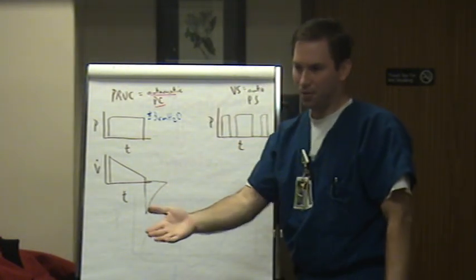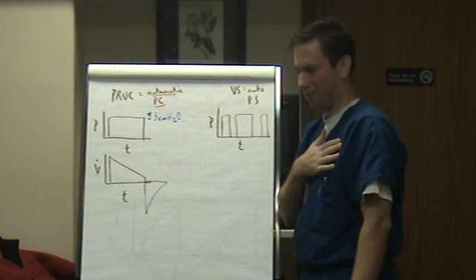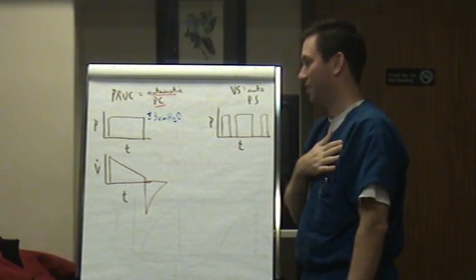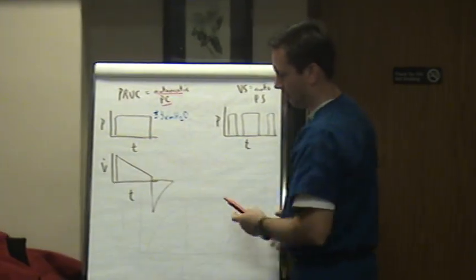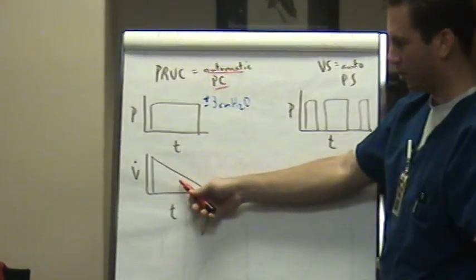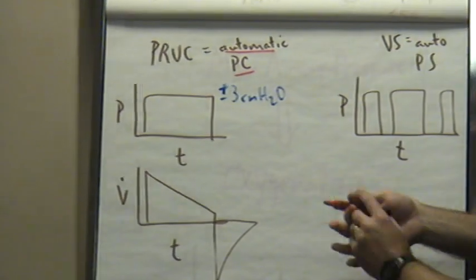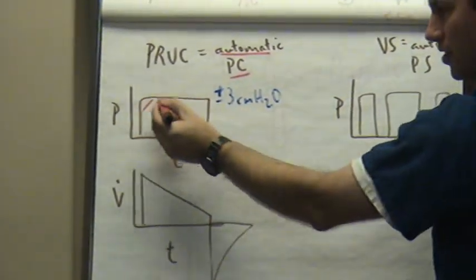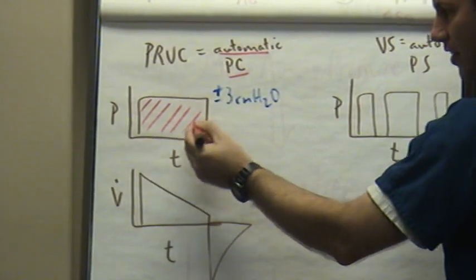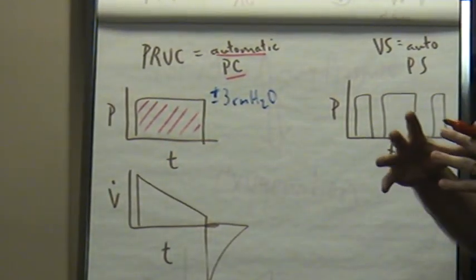And you can have your way with your tidal volume, and I can have my way with the most comfortable way to deliver the breath and the safest way to deliver the breath. And I just wanted to add this to show you that it's delivered with the decelerating flow pattern we just got through talking about, and a square pressure waveform. It still rises up to that pressure and holds it. And that's key, because if it pressurizes the lung instantly, it's going to pressurize and hold it.